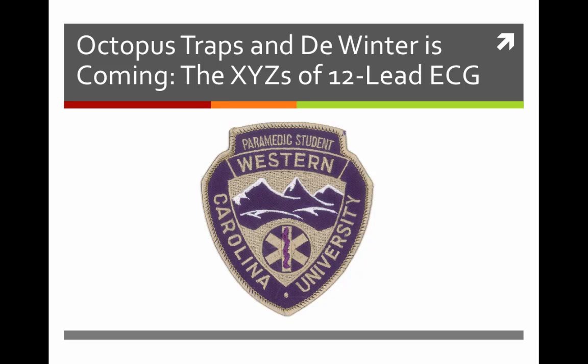So you've had your basic EKG classes, you've had your basic 12 lead EKG classes. We've done the ABCs, gone over LVH, RVH, bundle branch blocks, all that, all the boring stuff. Here, let's go over the fun stuff, the XYZs of your 12 lead, and let's see what we can pluck out and maybe impress a cardiologist or three.